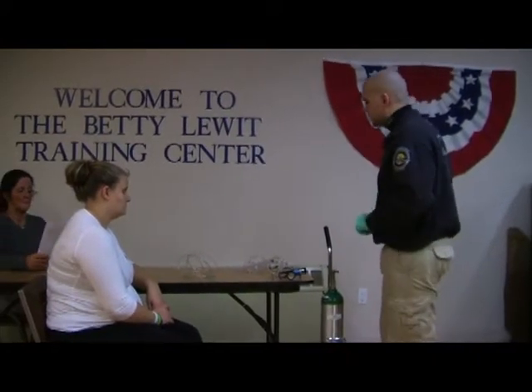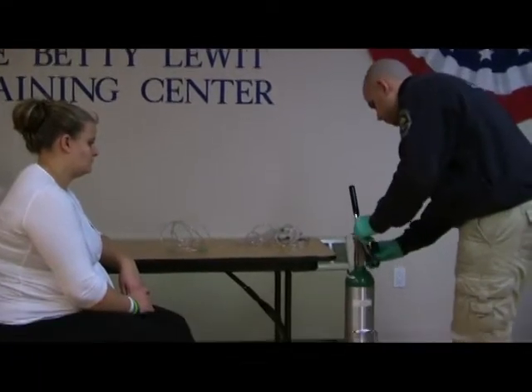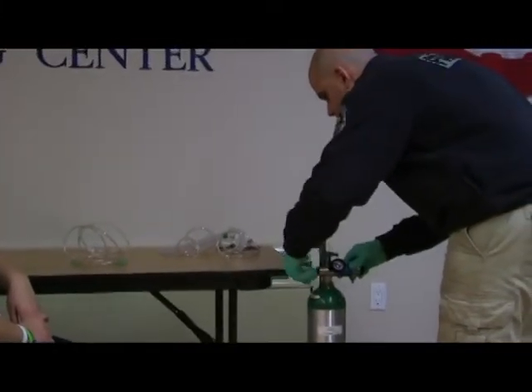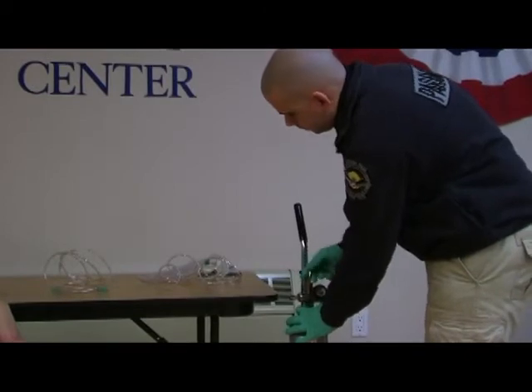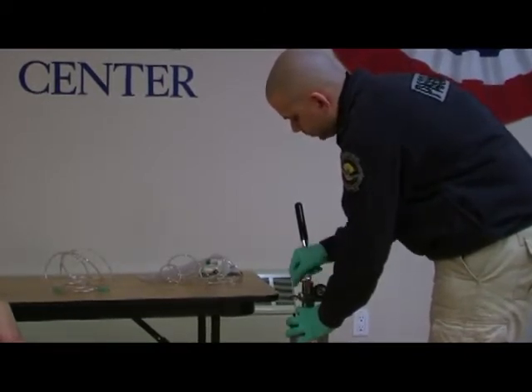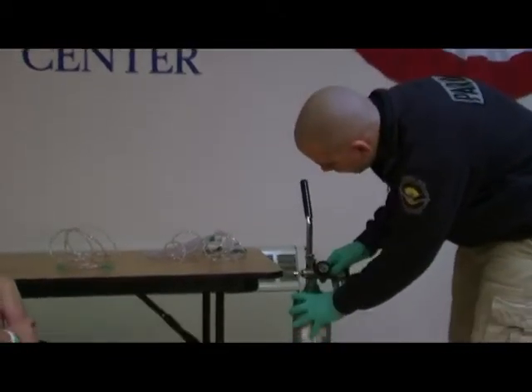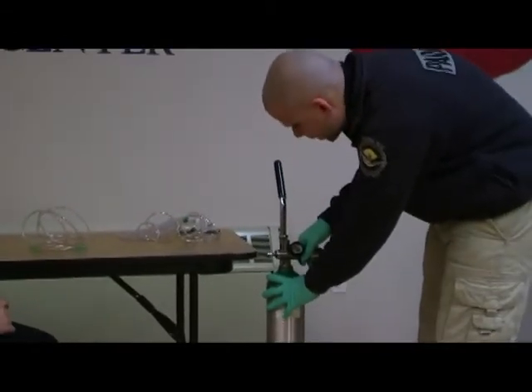BSI. I'm going to start by attaching my regulator to my oxygen tank. I'm going to open my oxygen tank. I'm going to check for any leaks and I'm going to visualize the PSI — I have a thousand PSI in this tank.